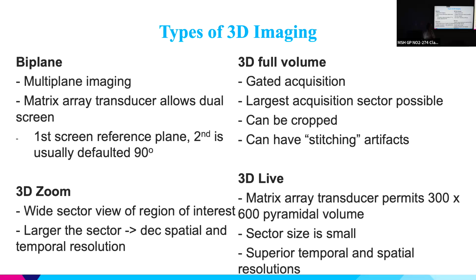So 3D Live, it's whatever you see on your screen. The sector is very narrow, so your elevation width is narrow, and that's why I think the resolution is so good. It has the most superior temporal and spatial resolutions of all of the imaging modalities. Just make sure that whatever you're imaging, because the elevation width is so narrow, is in the plane that you're acquiring, and I'll go through that.